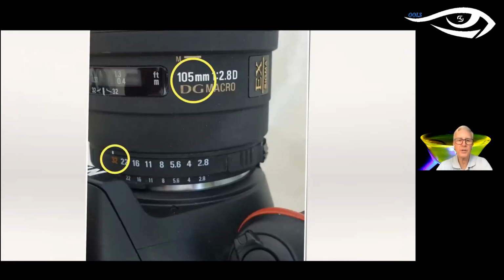And the other thing you notice is f/32, and the students are probably up on this, but if you've been out of school for a while, you may not remember that the higher the f-stop, the smaller the aperture. So f/32 is almost like a pinhole, whereas f/2.8 is a very, very wide image. So what does a pinhole do? We all know that it gives us a larger depth of field.